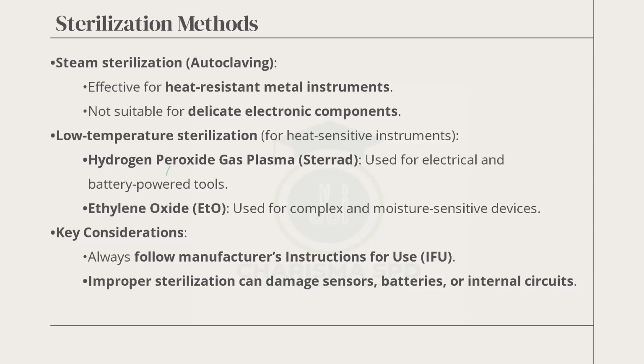The STERRAD processing technique is low temperature, used for electrical and battery powered instruments. Those that cannot withstand the heat from the steam go through the low temperature.